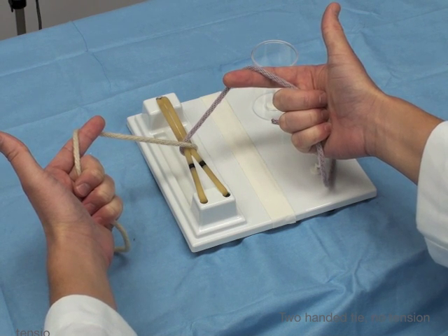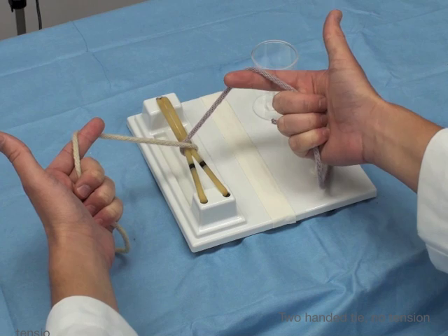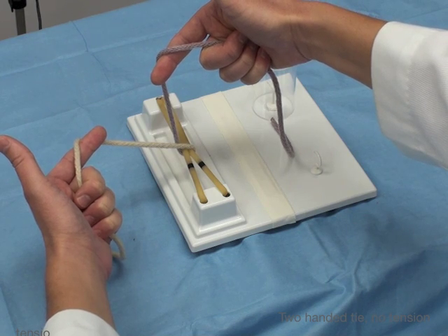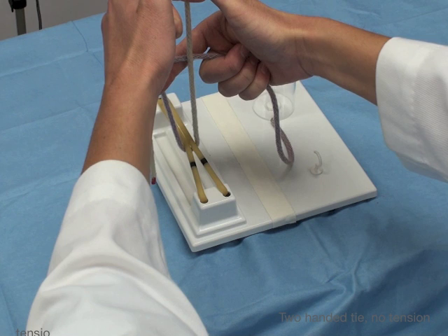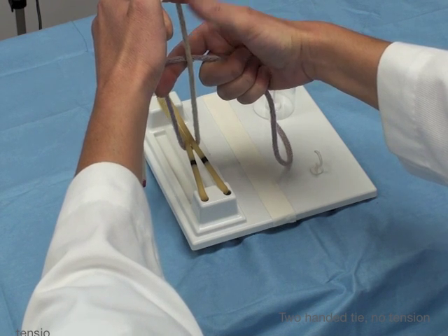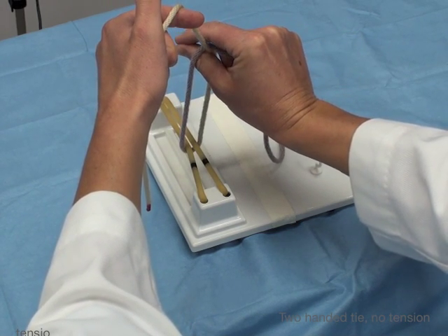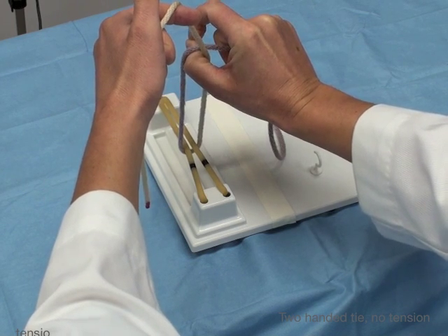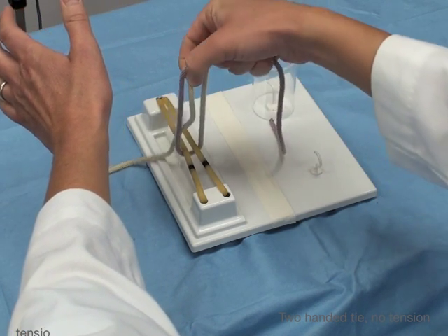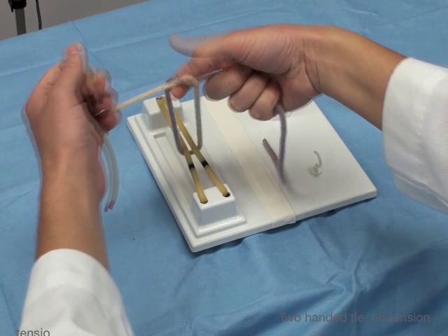What you want to do then is make a cross with the strands. You take the hand that's going to be doing the suturing — in this case my dominant hand, my right hand — bring it to the midline, and then make a cross over that strand with my non-dominant hand, which is the white in this case. Then I make a perfect sign. I push the perfect sign through. Now don't do a perfect sign with the pads of the finger — do it with the tips of the finger. I push it through, I hand off the white strand, let go, push it back through, grasp it, and now I've thrown my first throw for the knot.